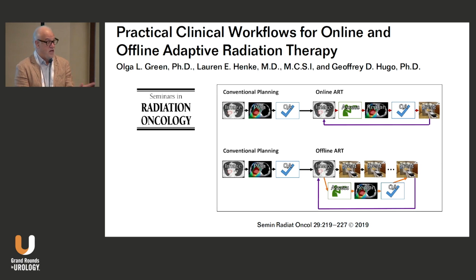intensity modulated radiation therapy, IMRT, the machine is designed to move around the patient or have different angles with leaves that can come in and out of the field and modulate the radiation. But in order to verify that we are doing the correct dose before a patient is actually treated, we do a QA process where we have a phantom and we run the plan and make sure that the dose distribution is indeed what we're seeing, just as a QA validation.